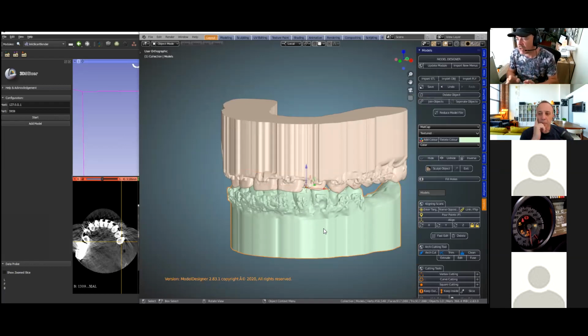Wolf, have you got any questions about this that you can think of? No, so would you make two segmentation models or just one in 3D Slicer? You just make one. Just one segmentation. Can you turn your mic up a bit, Wolf? Yes, just a minute. Okay.